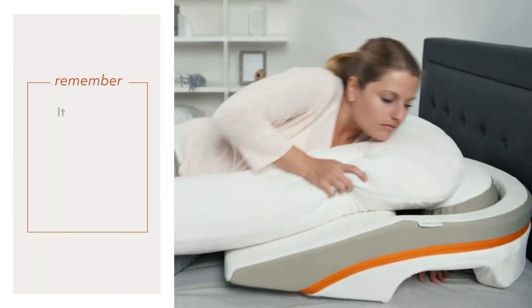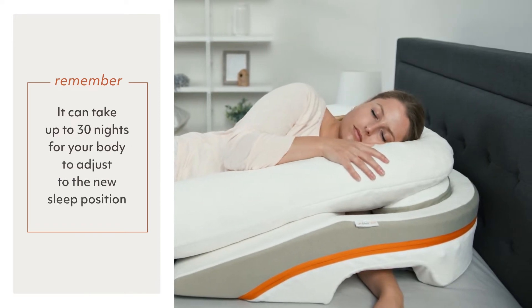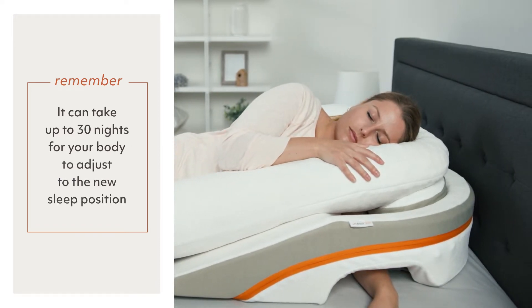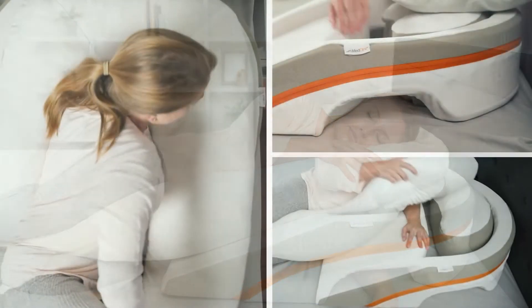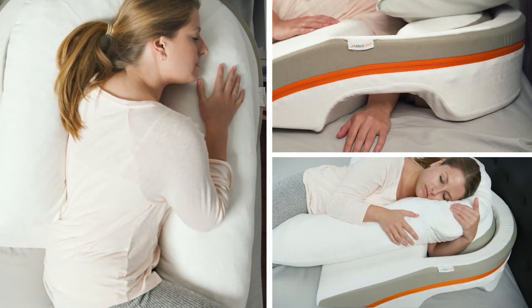First, it's important to note that it can take up to 30 nights for your body to adjust to the new sleep position created by MedCline. Depending on how you've been sleeping for the decades before MedCline, the adjustment might take as little as two to three nights or may take longer.